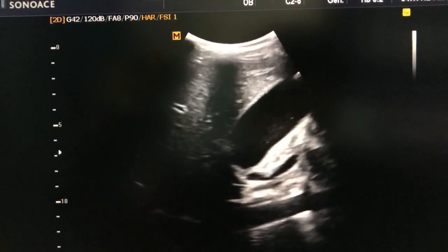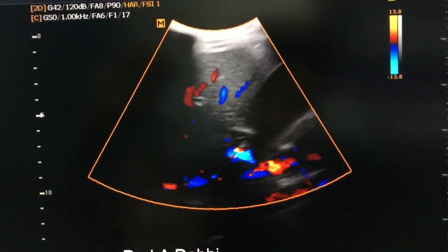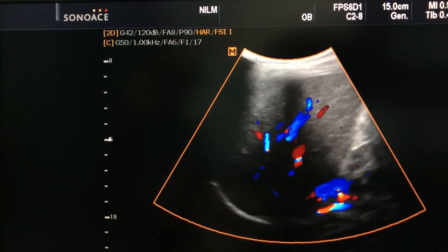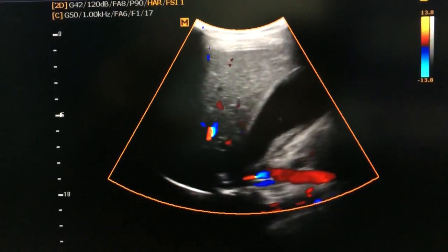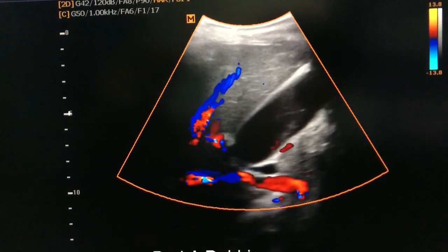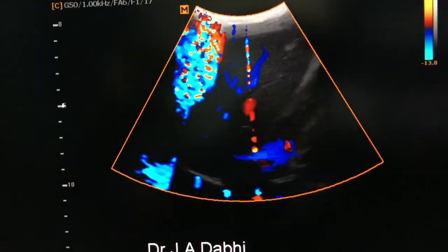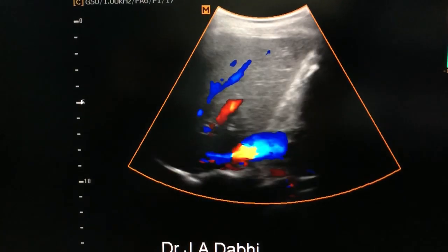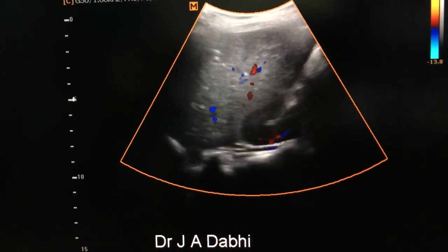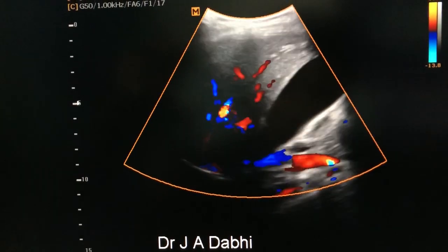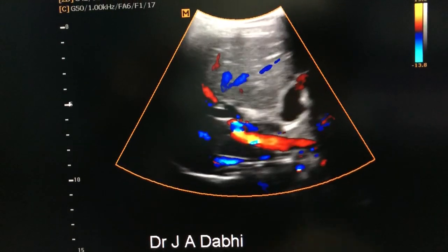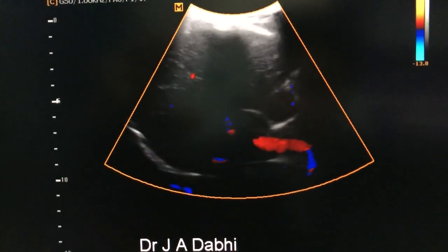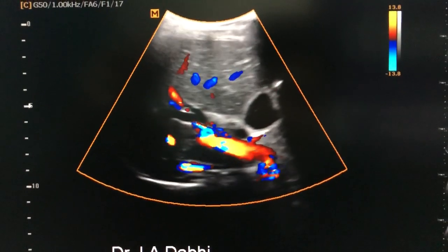The second finding is that big biliary tract dilatation is seen within the liver also. We can observe a cystic tubular area which is not taking colour flow — that is the dilated biliary radicle.